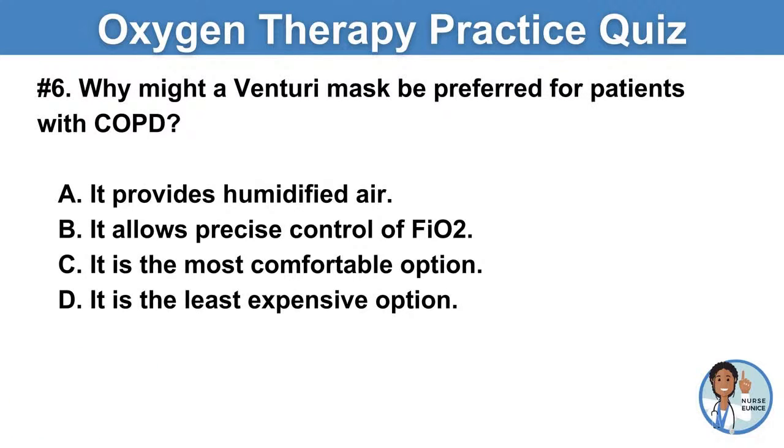Why might a Venturi mask be preferred for patients with COPD? It provides humidified air. It allows precise control of FiO2. It is the most comfortable option. It is the least expensive option.